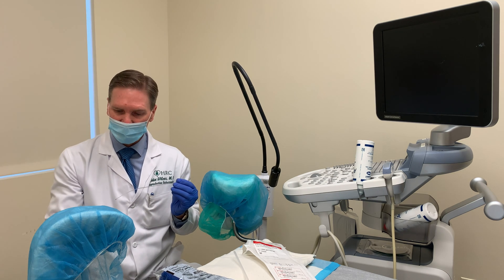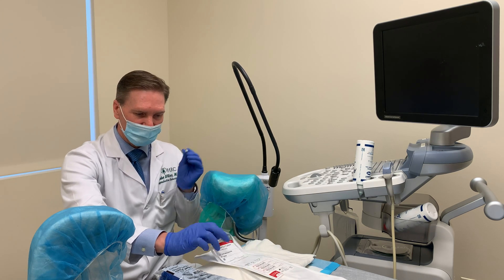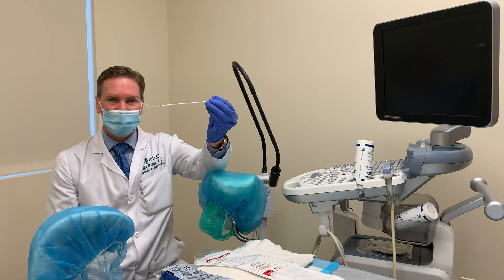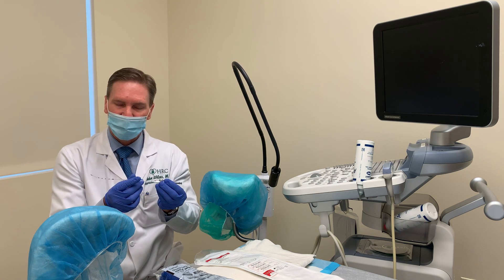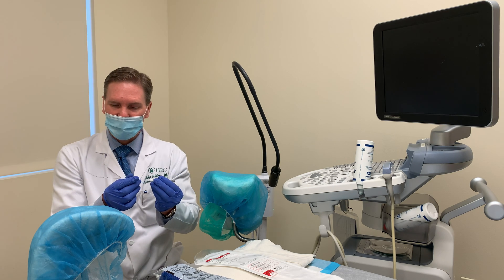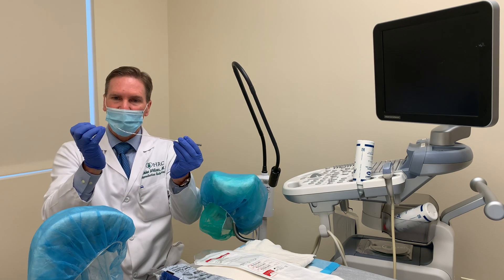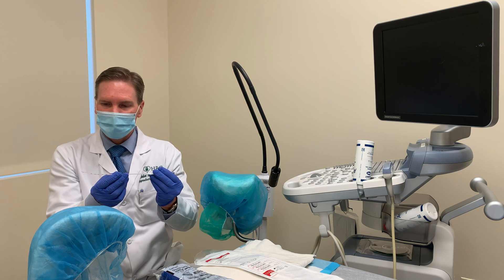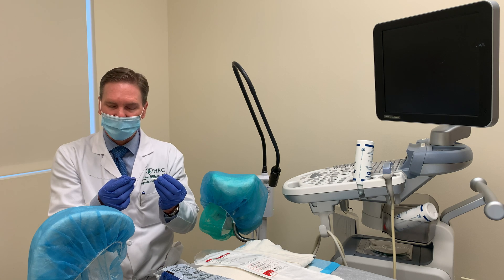We have a guide here — this guide allows us to shape the catheter. When doing the actual transfer, we don't want to touch the tip; we try to keep that sterile. We can shape it and it'll retain a little memory so we can gently thread the catheter through. Most people don't feel anything when we do that. It's got markers on here which tell me the depth of penetration, so I can use not only the ultrasound to see the tip of the catheter — since it's got a little bit of wire in the tip it shows up very nicely on the ultrasound as a bright signal — but I also have these measurements for additional feedback if I'm having trouble finding my tip.